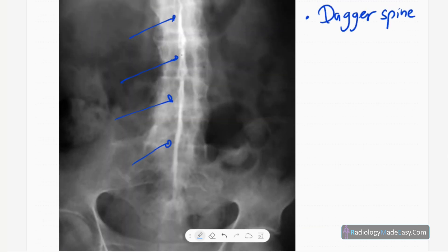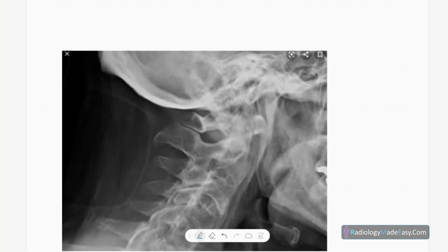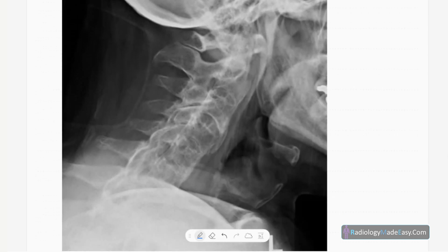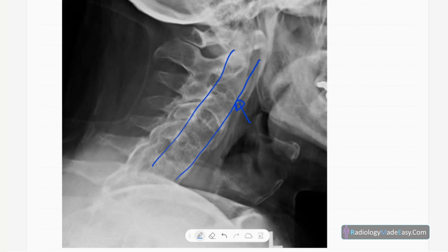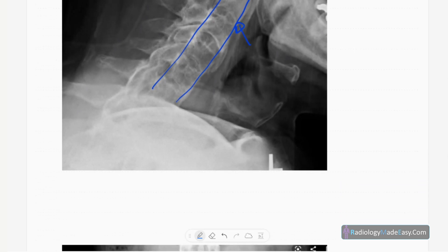Slight scoliosis is also present. On the lateral cervical spine radiograph, you can see ossification of the anterior longitudinal ligament, syndesmophyte formation, and fusion of the cervical spine. This is another example of ossification of the anterior longitudinal ligament.